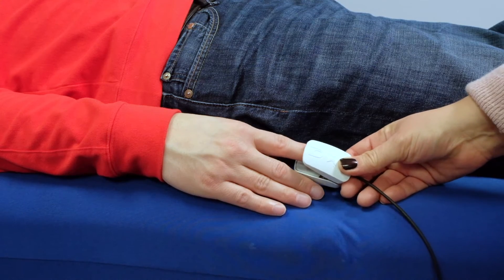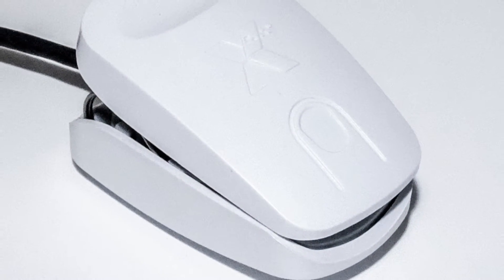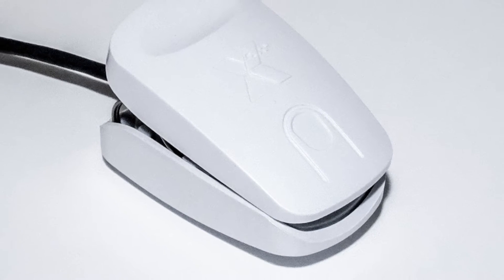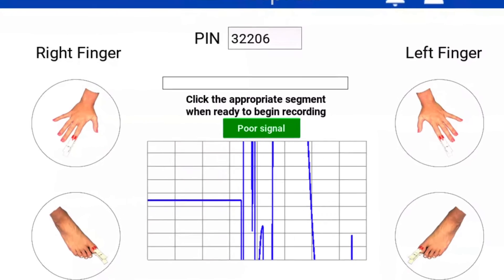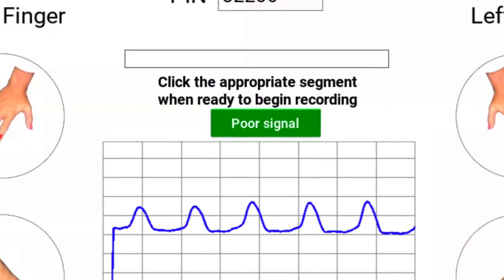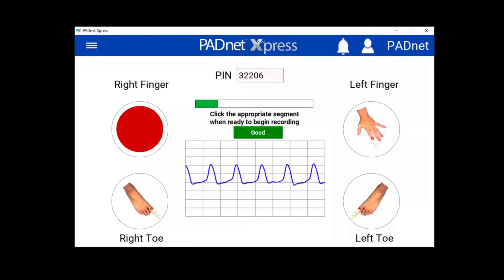Start the test by placing the probe on your patient's finger. The sensor ignores ambient light, so there is no need to adjust lighting where you are performing the test. PadNet Express has a dynamic signal quality indicator to ensure test quality. Click on the desired finger to record the segment.